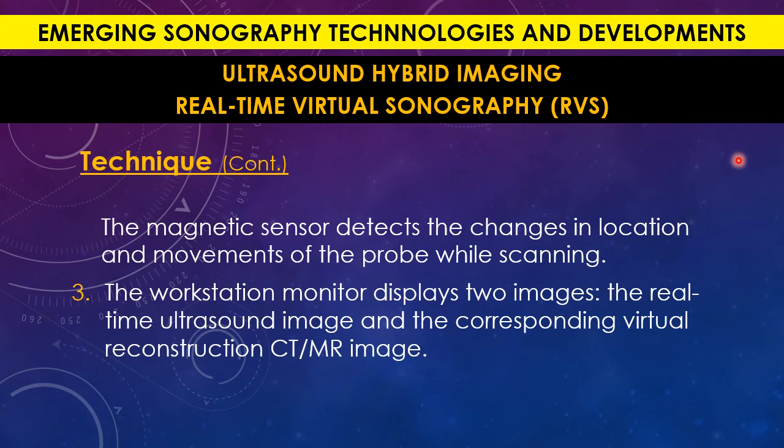So this workstation monitor is displaying the ultrasound that is currently being performed and the corresponding virtual reconstruction of the MRI or CT images. So you have here on the workstation display two images: one image for the CT or the MRI that has been saved already, and in the meantime, you have the ultrasound display, which is the current scanning right now.